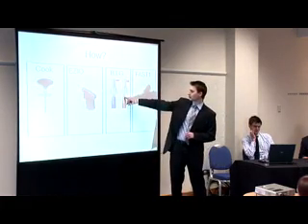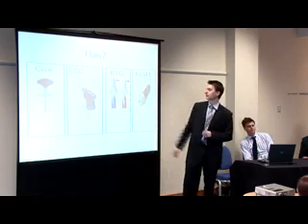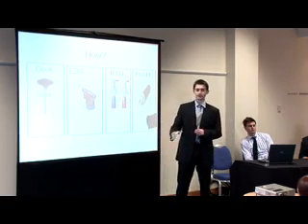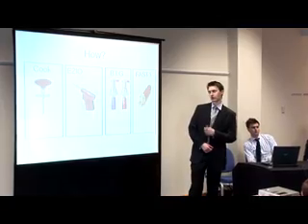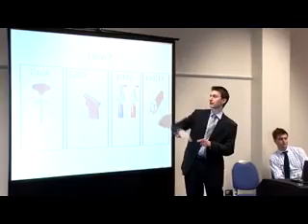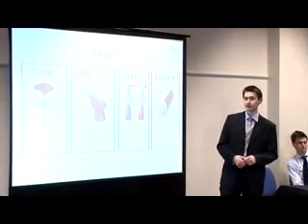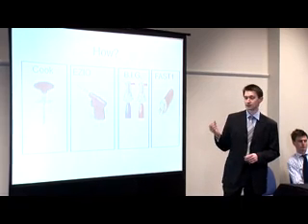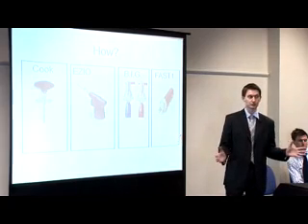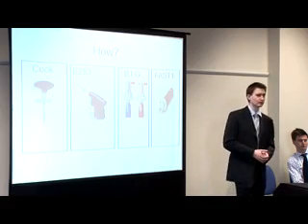For the pediatric one, you set the depth gauge, you just turn it, and it has an age in years. So you set it to correct depth. Adults, it's always at one depth. You hold it on the limb at the right site, which we'll talk about in a bit. And then you pull out the red part at the top, put a little bit of pressure on the top of it, and it fires straight into the depth, which has already been set. Okay? Set the depth, or just put it on an adult, hold it firmly, pull out the top, push it in, and it fires.